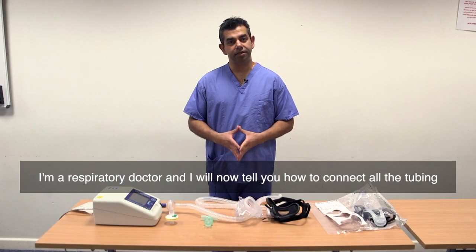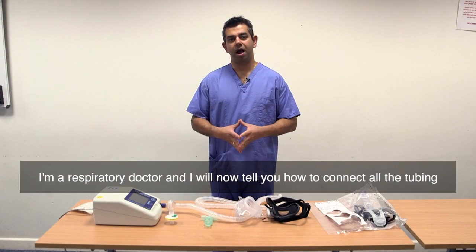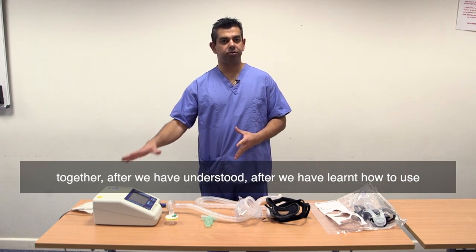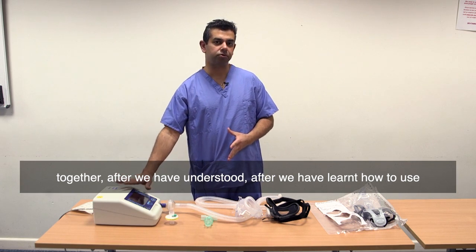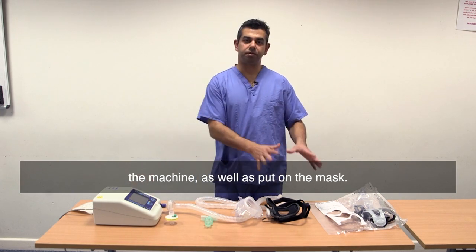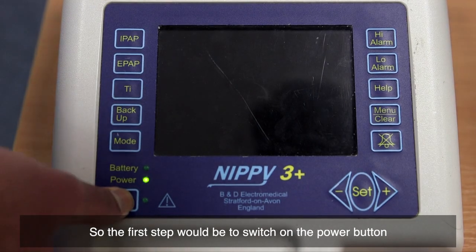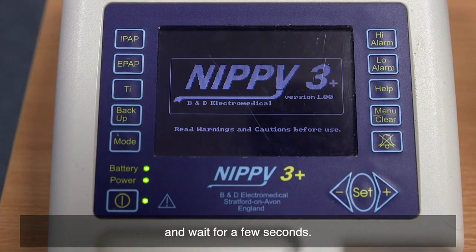I'm a respiratory doctor and I will now tell you how to connect all the tubing together, after we have learned how to use the machine as well as put up the mask. The first step would be to switch on the power button and wait for a few seconds.